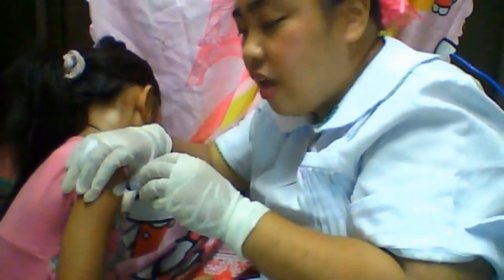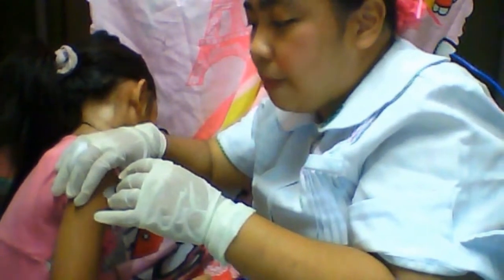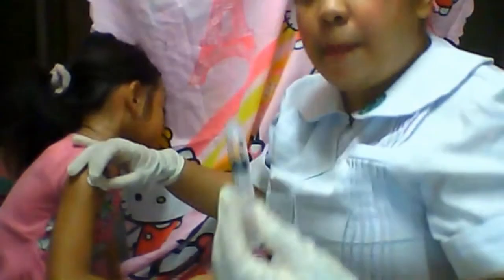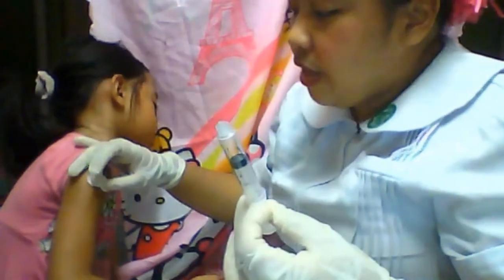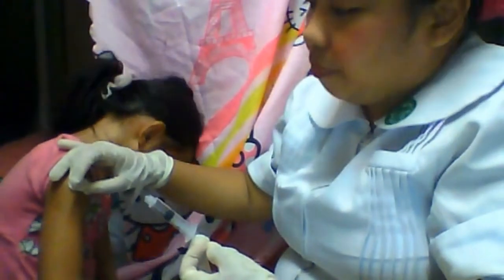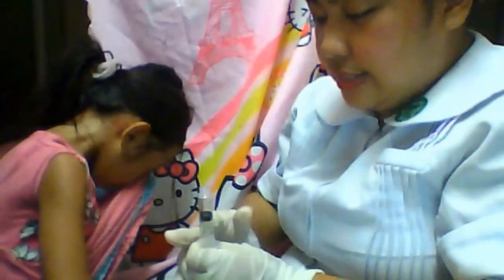So you have to remove, for example, if it happened, and then prepare another medication, prepare a new one. Okay, and then look for a different site, so go on the other arm. Okay, but for example, let's say that is not the case.